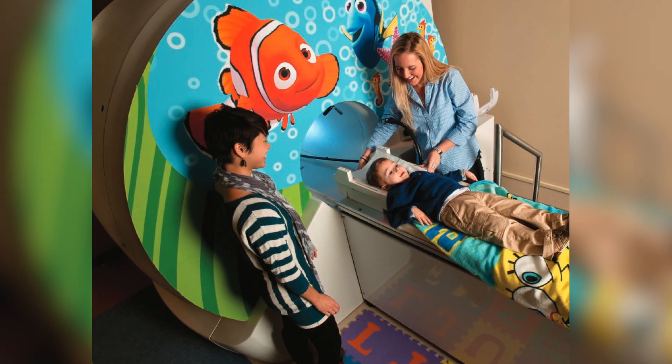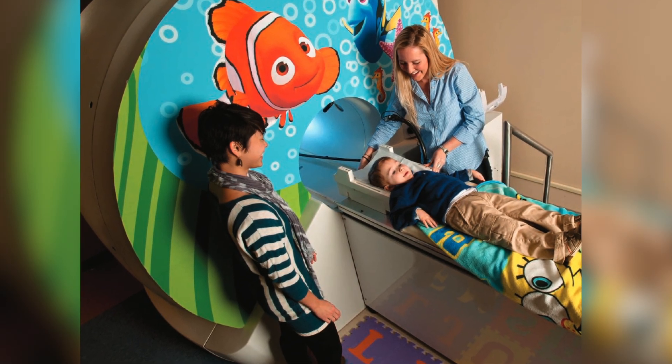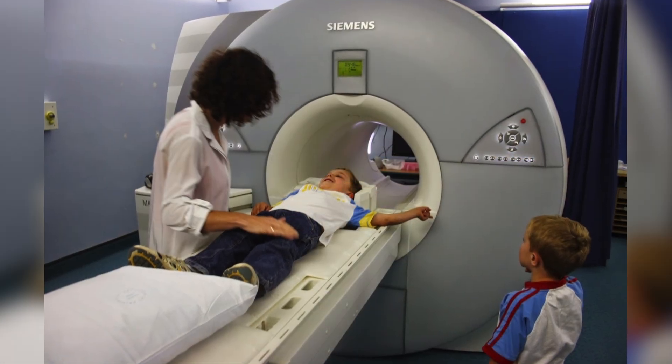So what has been happening lately in the research world is to acclimate the children to the scanning environment through mock MRI training sessions. In these sessions usually the kid will lay inside the tube and someone will be watching them and telling them whether or not they're moving too much. But the problem is that is reliant on the technician watching the kids and making sure they're not moving.